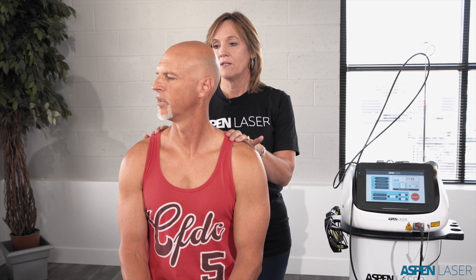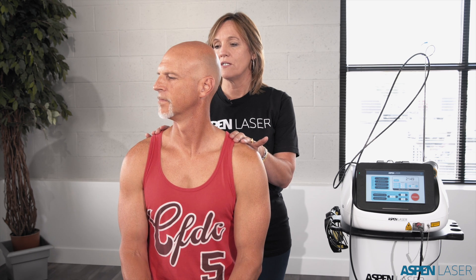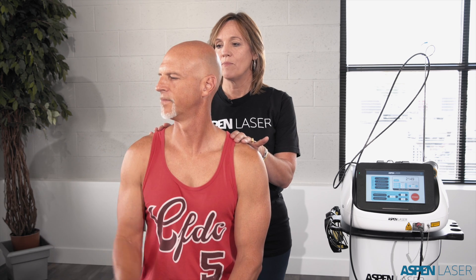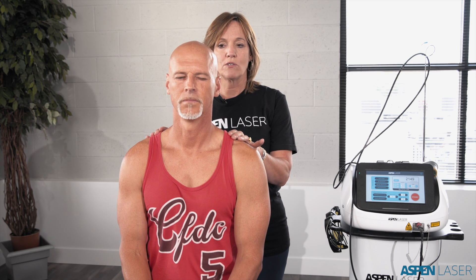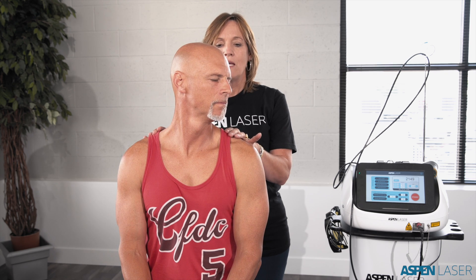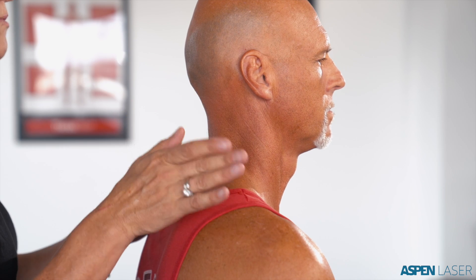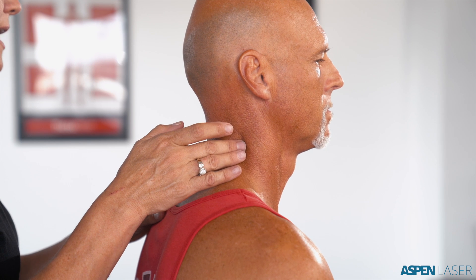Can you go any further? No. So your right eye is now closed — what do you see on the wall as far as you can go to the right before your nose blocks your vision? The bar in the center. Now let's repeat from center, go just the opposite direction, closing your left eye first. Go to the left. Tell me where the pain starts to increase. No pain. So the only increased discomfort is when you turn your chin to the right, and it went from a six to an eight. Is that correct? Correct.